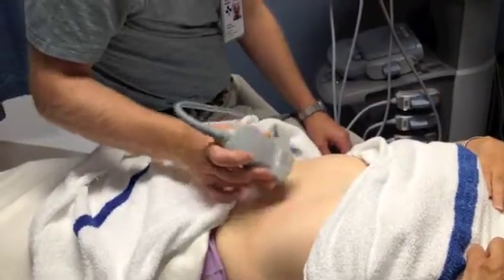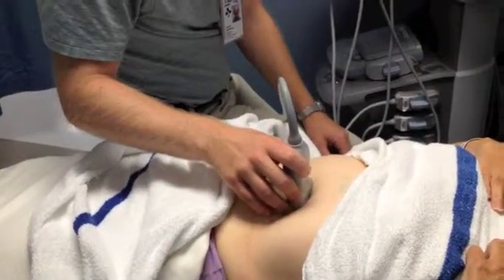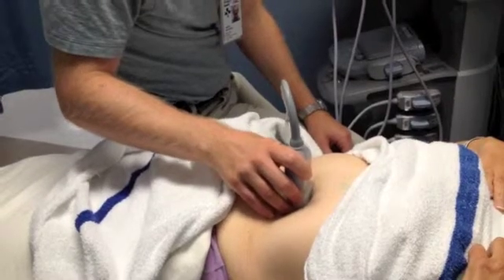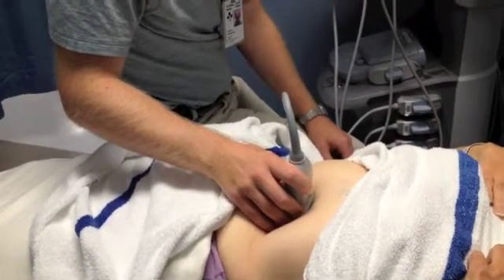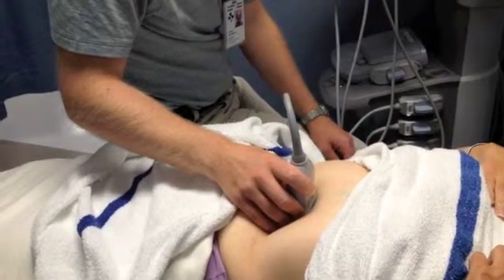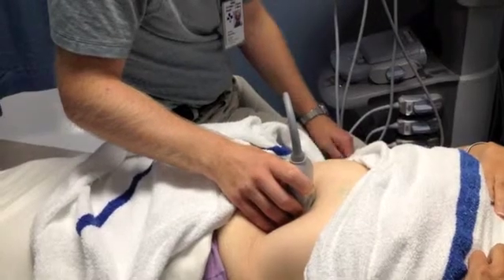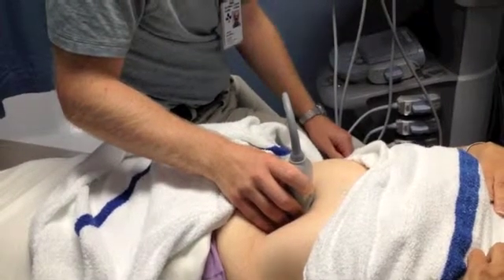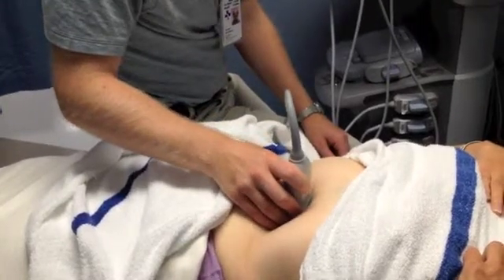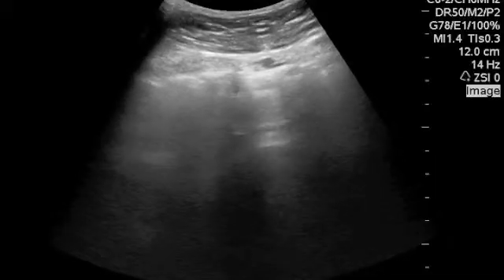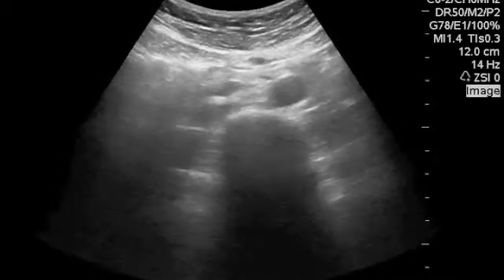Gas in the mid or distal aorta is better dealt with using compression. The way to apply compression is to push straight back with a slow, steady pressure and count to ten. If the gas still hasn't cleared, release the pressure and then slowly press again. Here we have an aorta that's difficult to see, but with compression, the image becomes clearer and clearer.